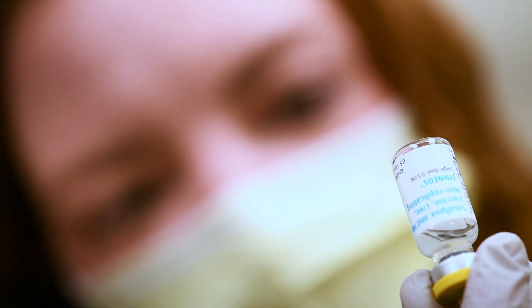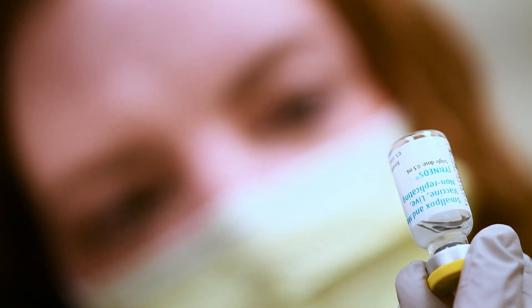Please note: one vial is equivalent to five doses of intradermal vaccine. However, most people are getting four to five doses.